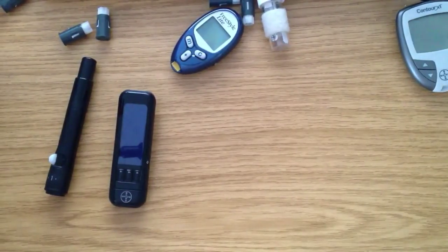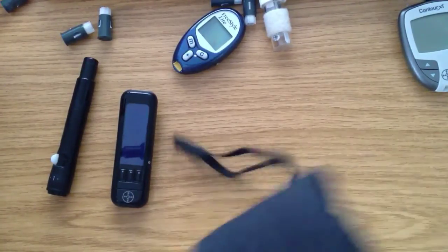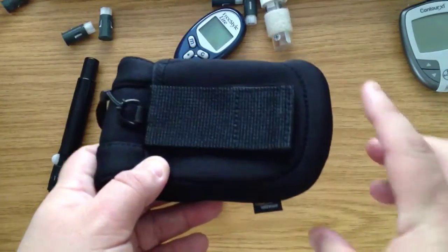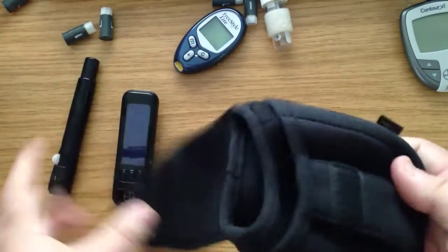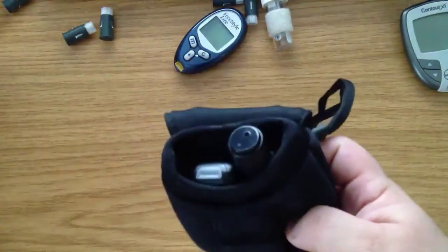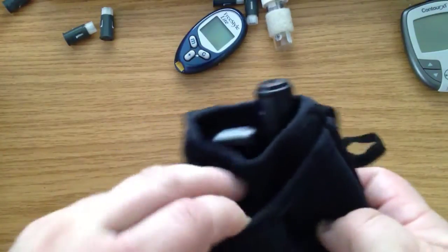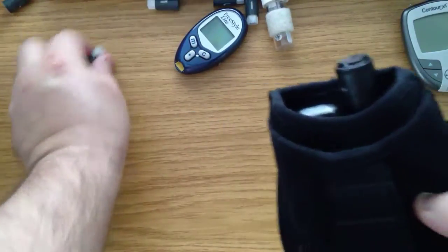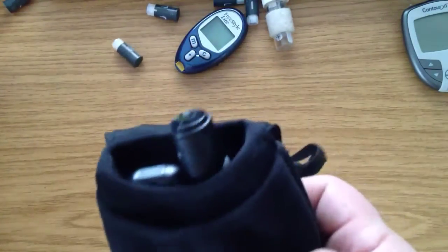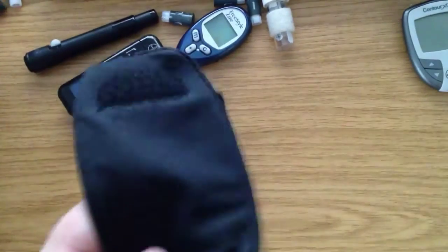More recently I wanted to put something more in there. Sometimes I just want something on my belt, and being a guy, what I tend to do is use one of these mini camera pouches. You can get these from Amazon. You can easily fit a meter in there, and your finger pricker. You can have a pouch for lancet drums that you can stuff in there, or test strips or wipes or whatever. It's quite small, but it will do.